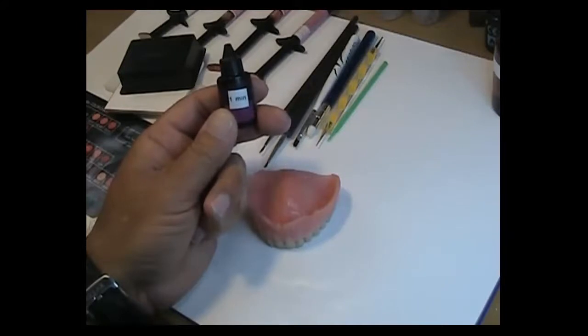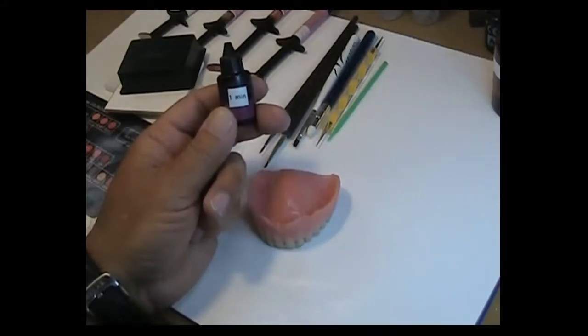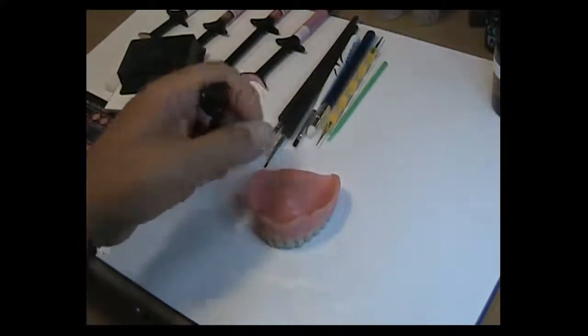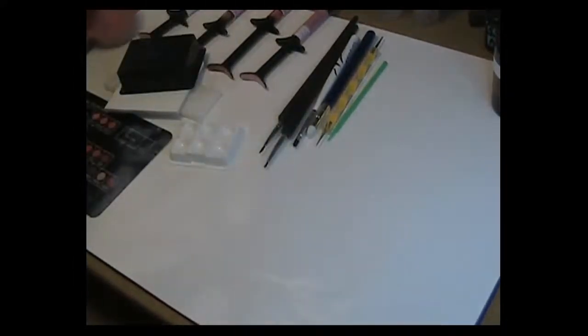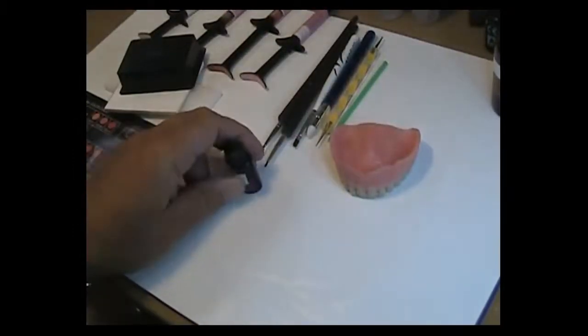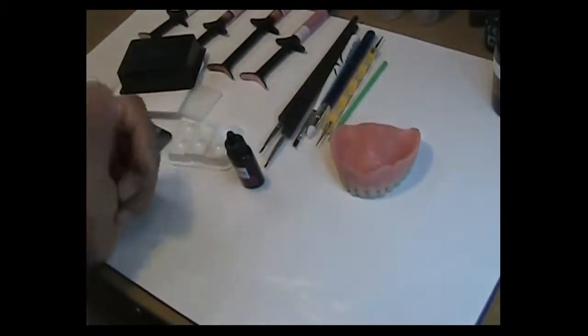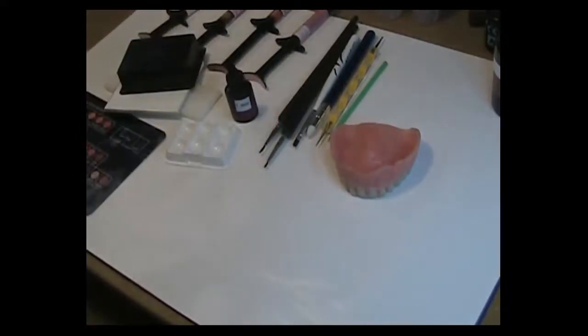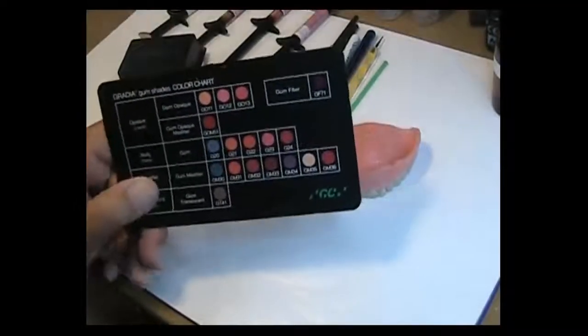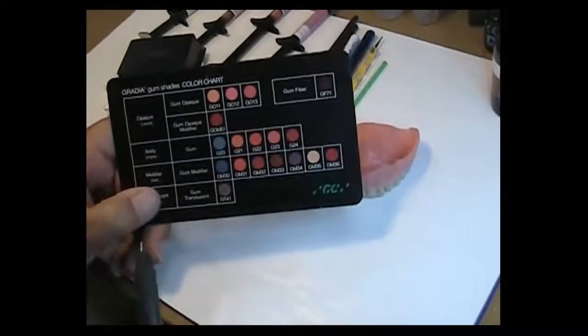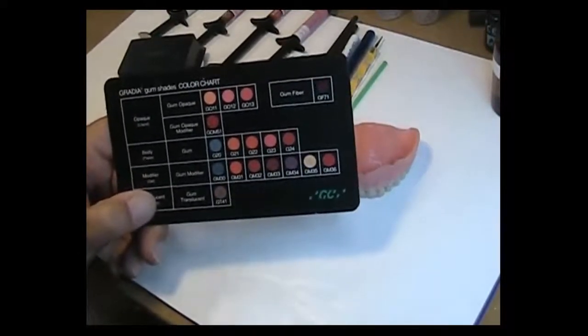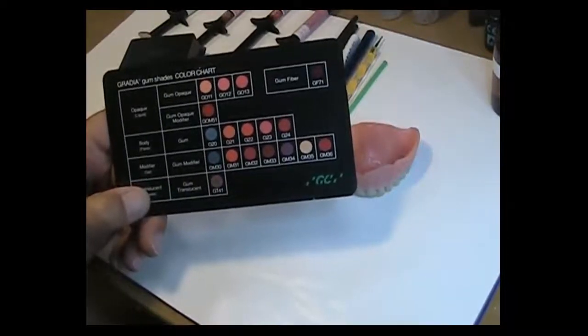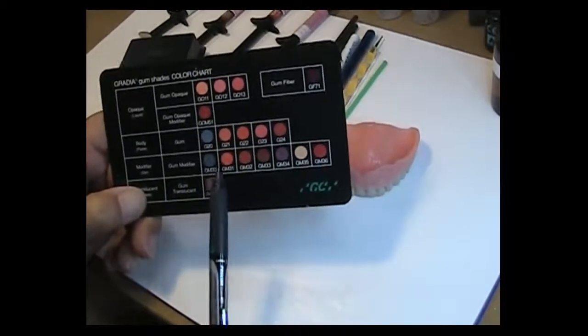Cure it under a labo light for about one minute. So one of the constituents after we have the denture prepared would be you have to have composite primer. And in the Gradia kits you'll see a card which will identify the products that come in the Gradia gum shade line.